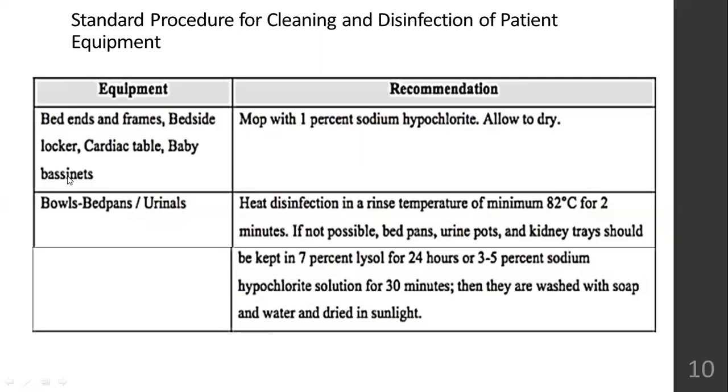Or if it is a government hospital and you can't afford to keep bedpans and urinals aside for an entire day, then you need a solution that works in 30 minutes, right? In half an hour, what you can do: 3 to 5% sodium hypochlorite solution will also work. Okay. After immersing it in sodium hypochlorite solution for 30 minutes, they are washed with soap and water and then dried in sunlight, and then the patient can use it. Okay, that is much more feasible.